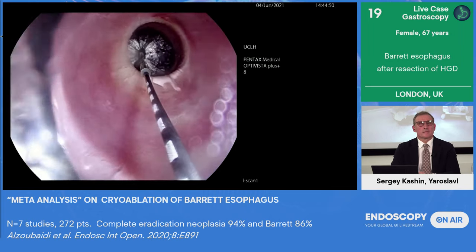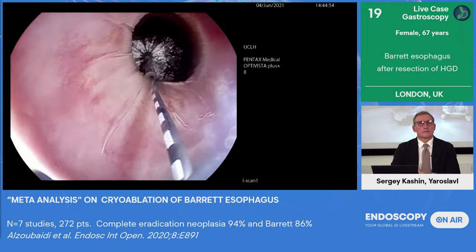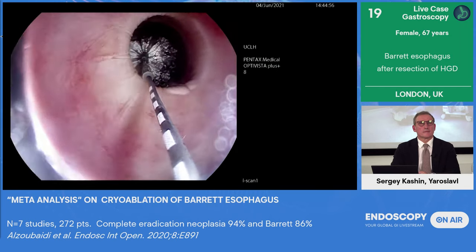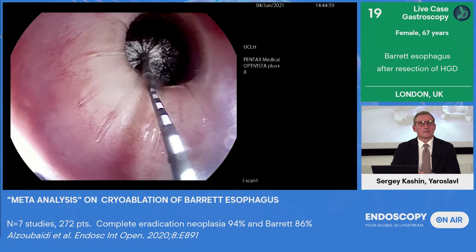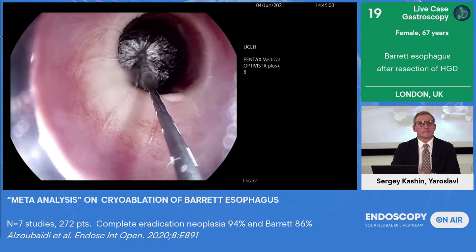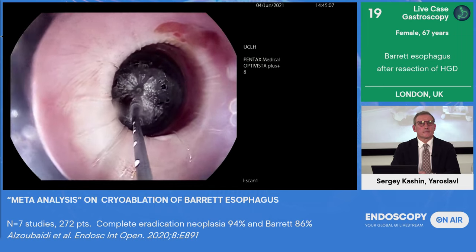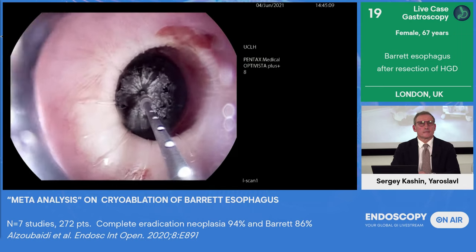So I'm going to do a couple of test sprays, as I call them. And then you can see my markers here, they're in the 12 o'clock position now. And that tells you that the spray is going to come out on the other side. So we're just going to be a little bit braver here and see if I can go across.